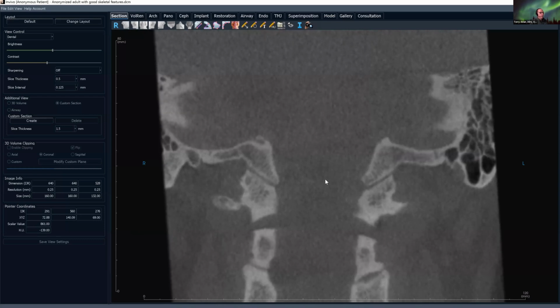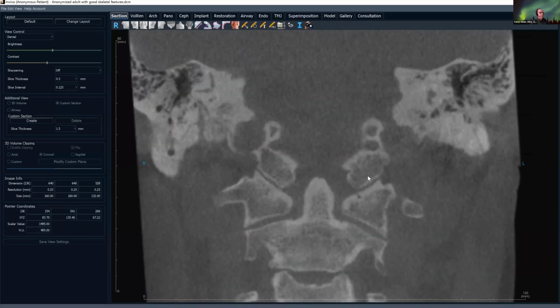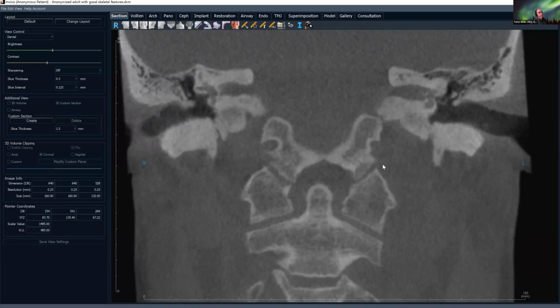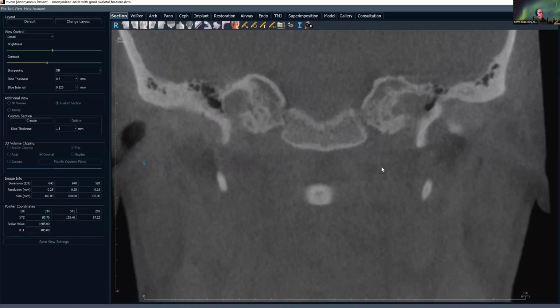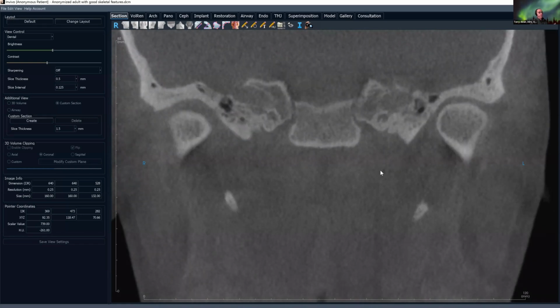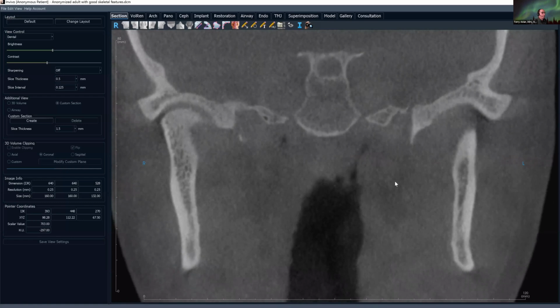Now, where I'm here in the posterior, I'm hand scrolling, so it'll give me a chance to kind of relook at some of these structures again that I may have missed. I'm scrolling through this quickly because I want to get to the dental structures. There's a couple of structures that are still important for us to find that we're going to come across momentarily.